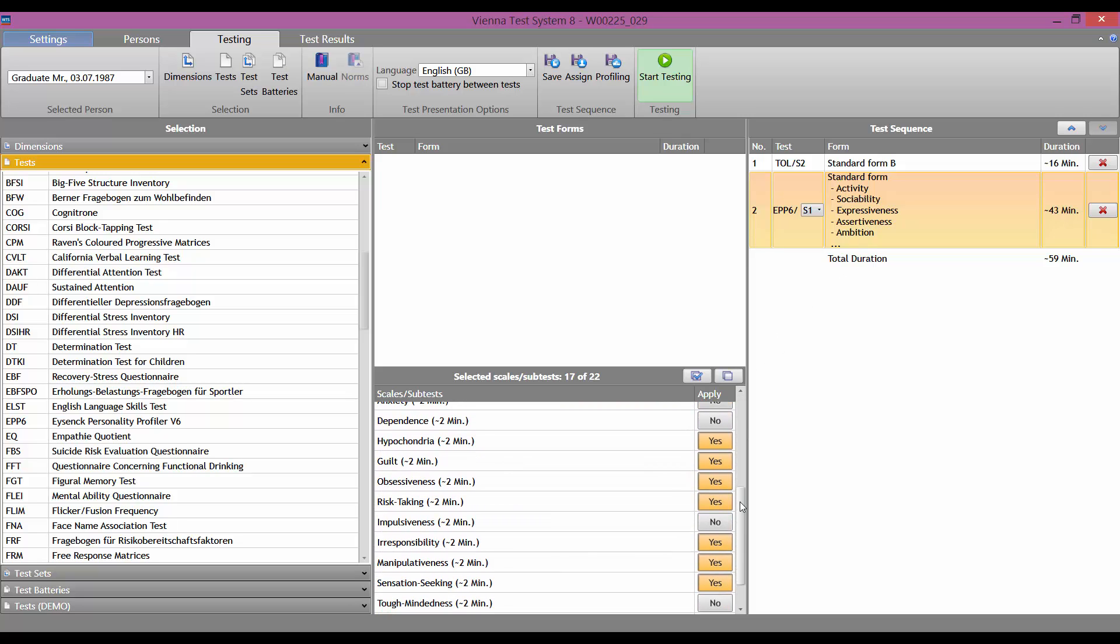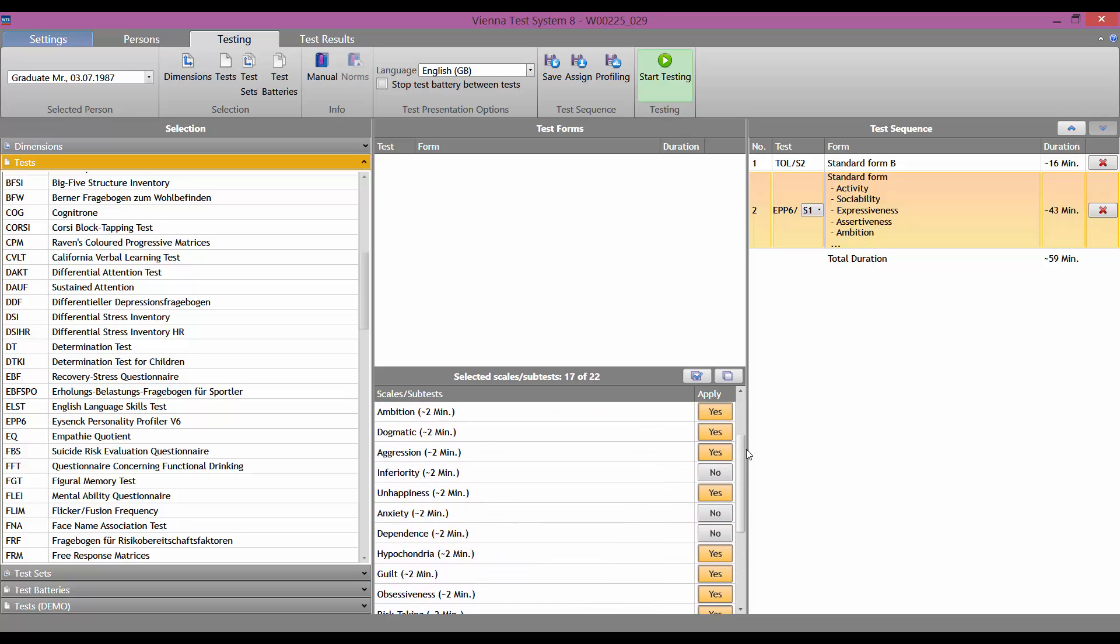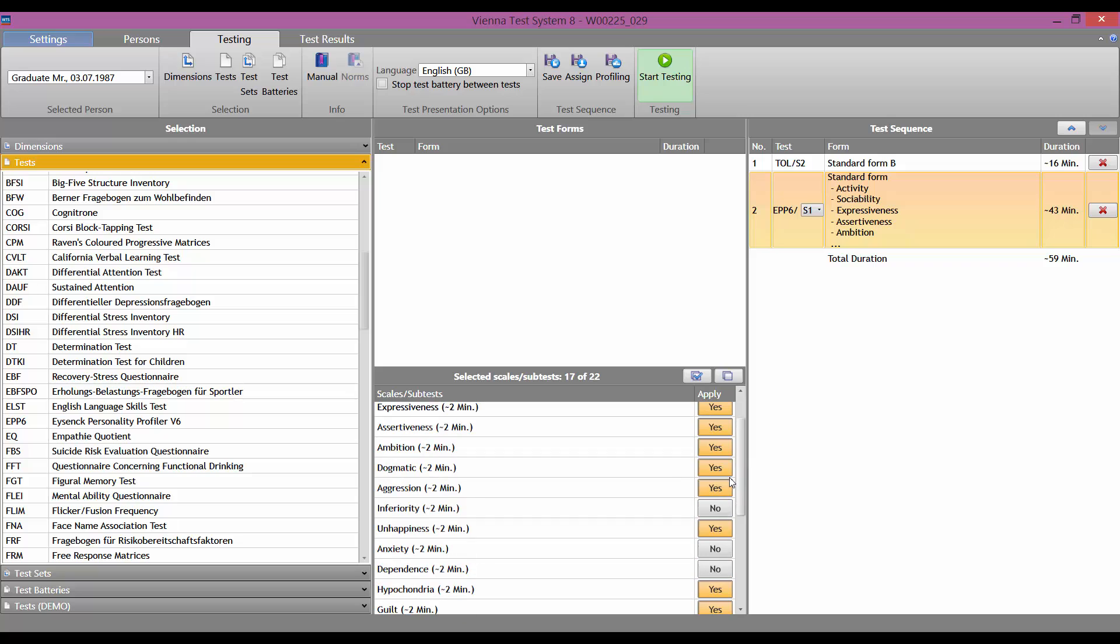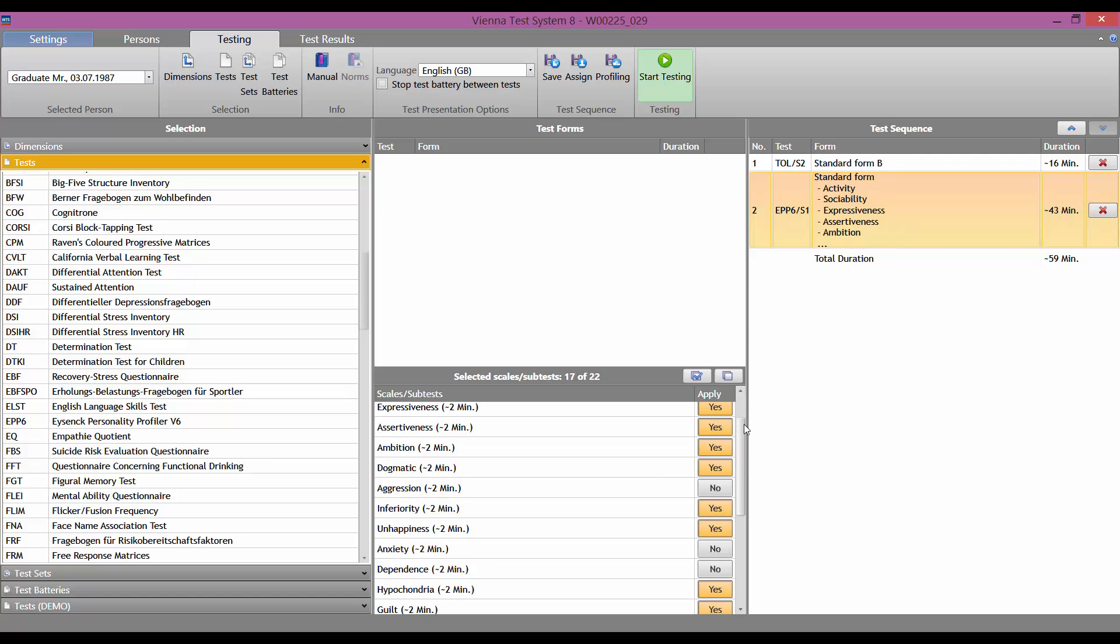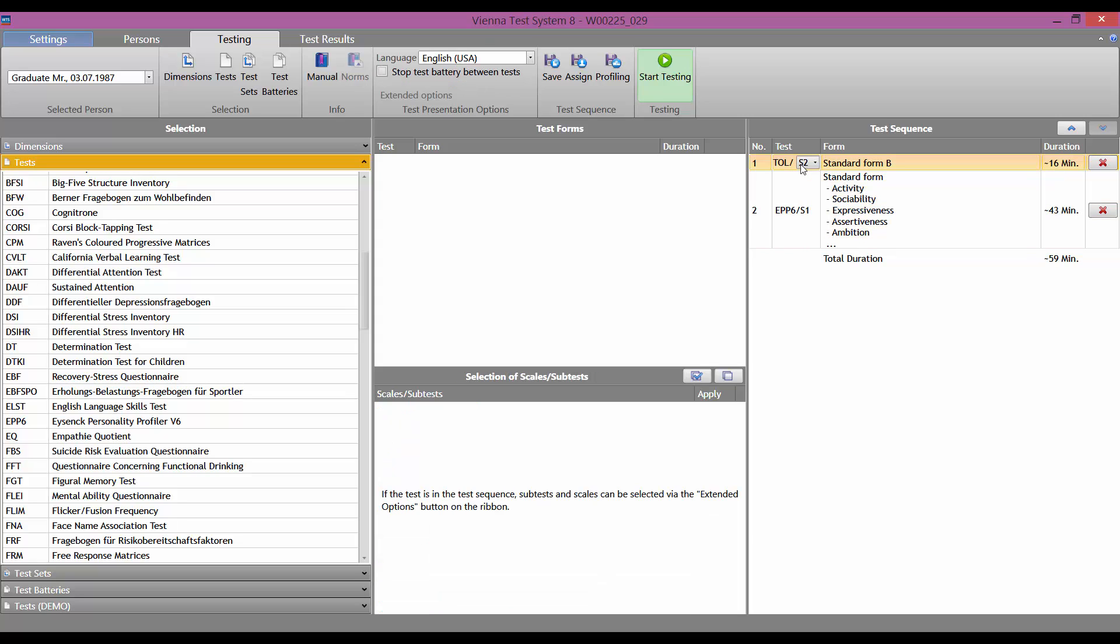For example, remove or add a scale. If you want to change the test form, click directly on the test form in the right-hand column. You can then set the required test form in this box.